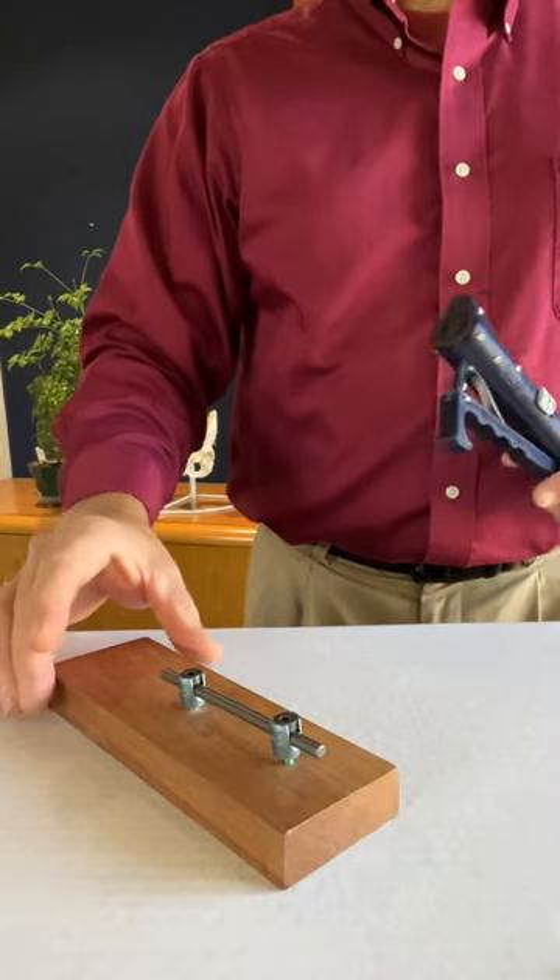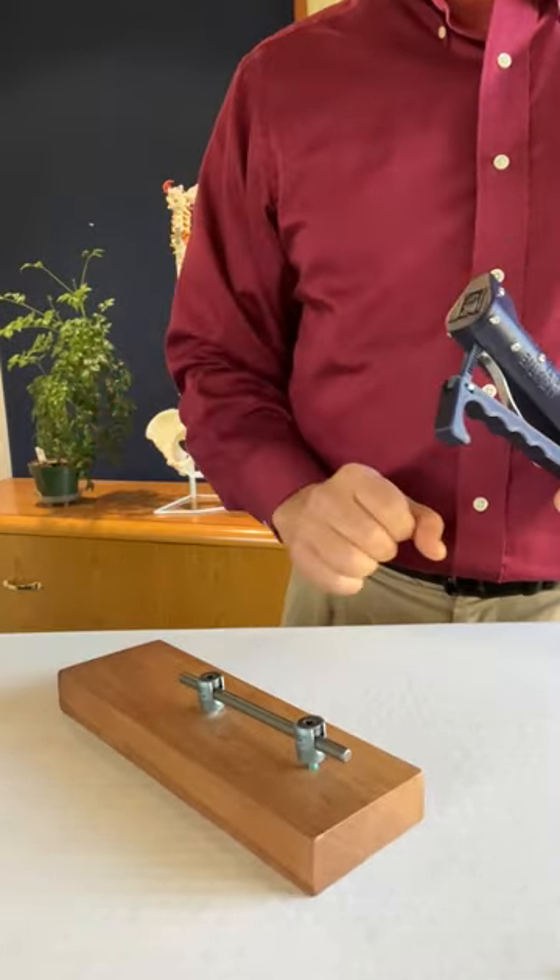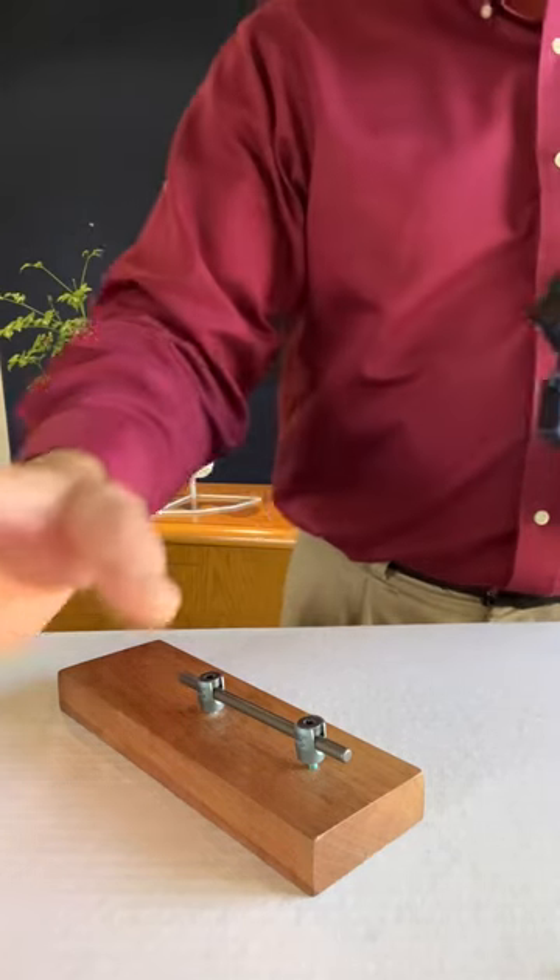All of this without stressing or moving the spinal construct or the patient's spinal column.